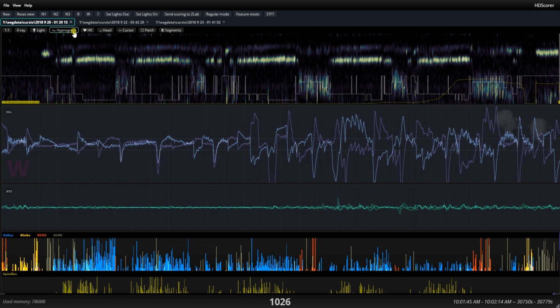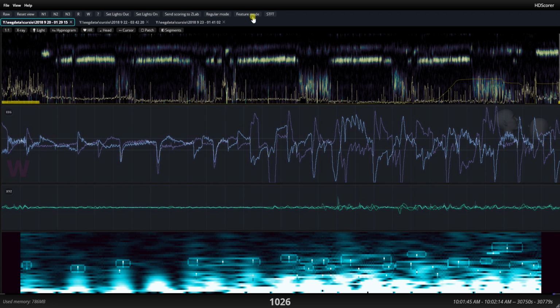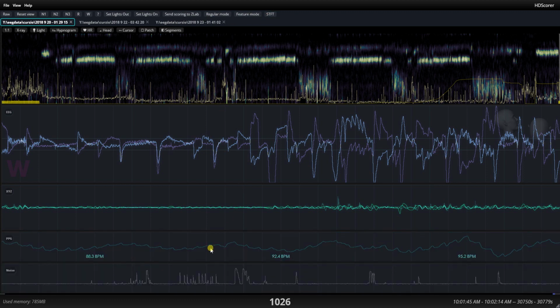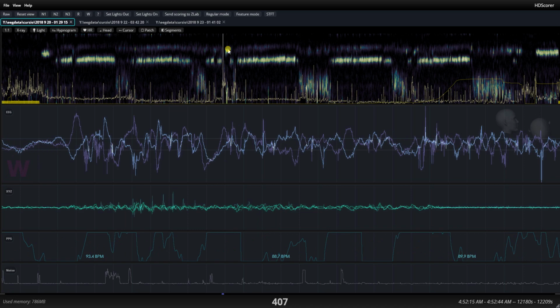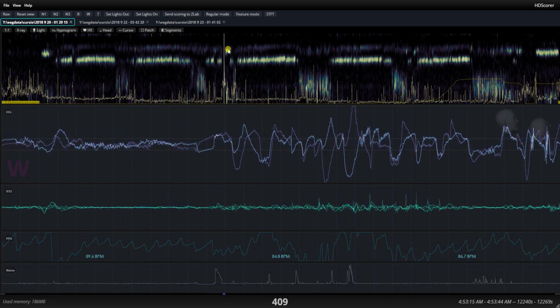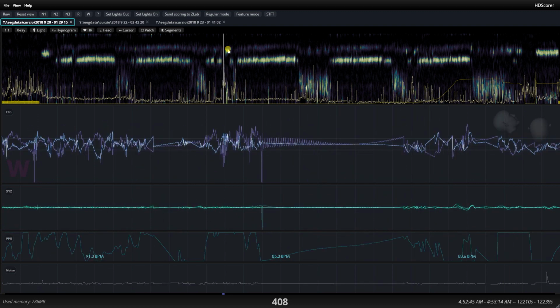Interesting things here. We can disable the hypnogram for a bit and change to the heart rate. Now the heart rate is going to be valid only when the patient is not moving, because we're calculating it using PPG. So if you look at the quality of PPG right here, it's borderline. Here it's very good. So you can see the wave very, very nicely shaped. If you take any one of these spikes, so like here, for example, I think I'm moving around and probably restroom break or something like that. So yeah, the whole signal is in disarray, so you would ignore this peak right here.